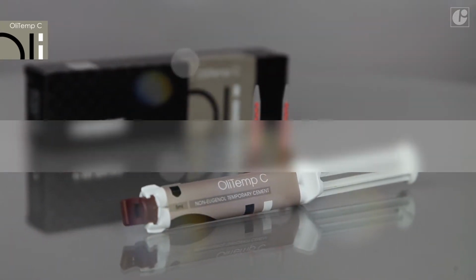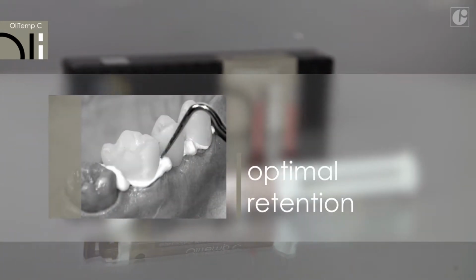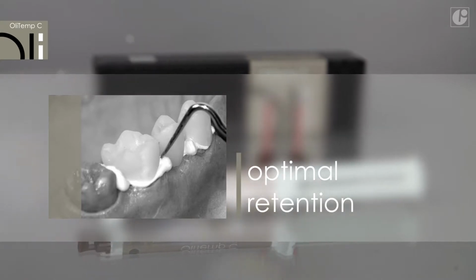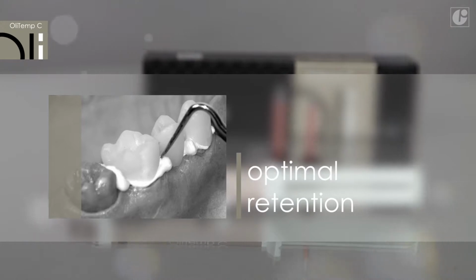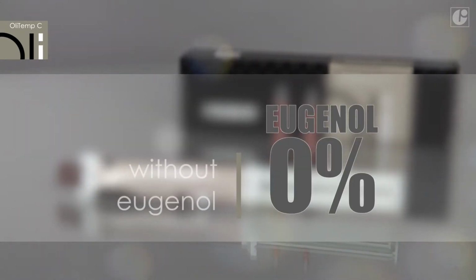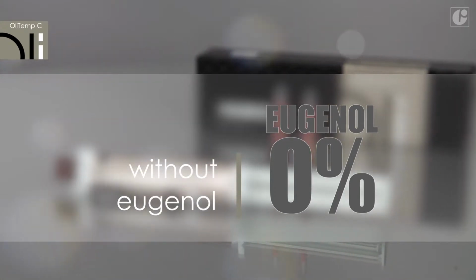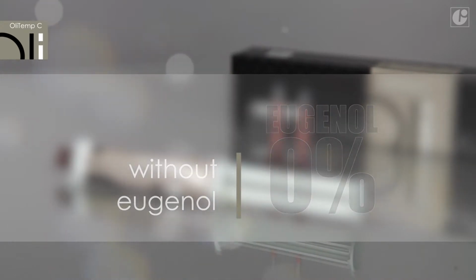The physical properties of OliTemp C enable trouble-free removal of the cement residues, safe retention of restorations, and, most of all, their easy removal. Both the abutments and the restorations do not require any laborious cleaning. OliTemp C does not contain eugenol, hence the negative impact on the adhesion of final composite cements is eliminated.